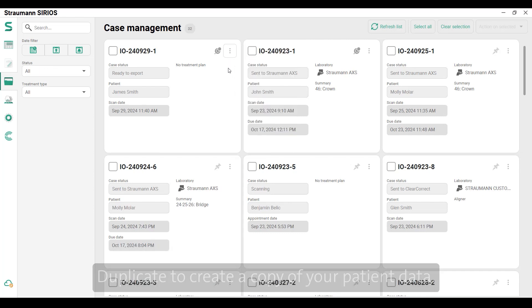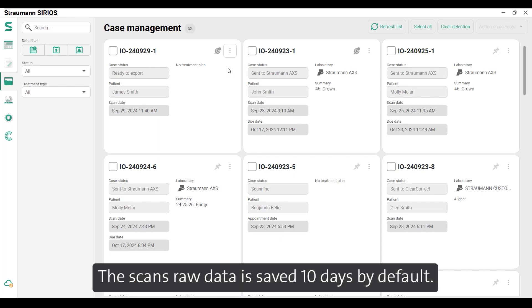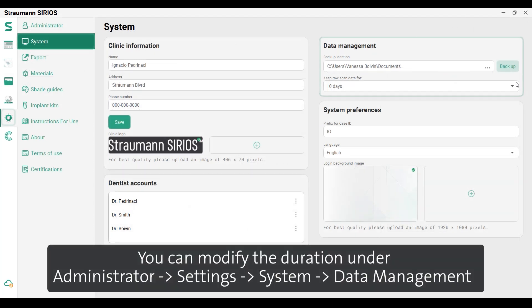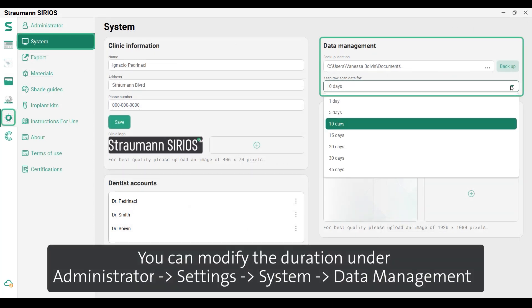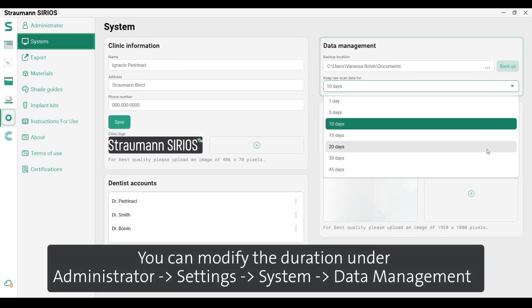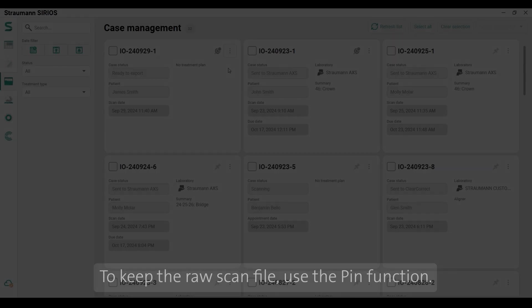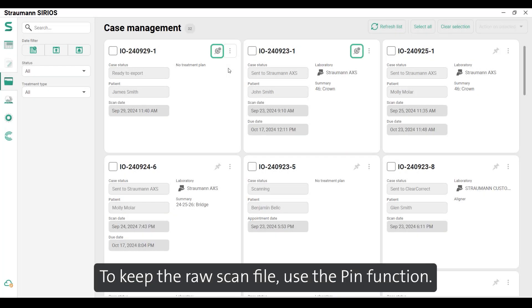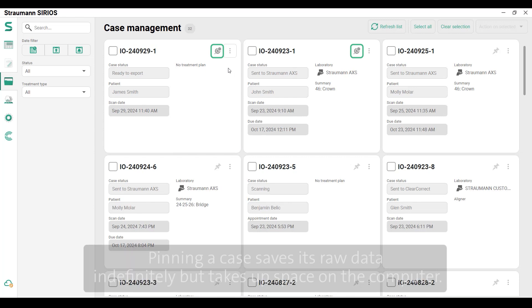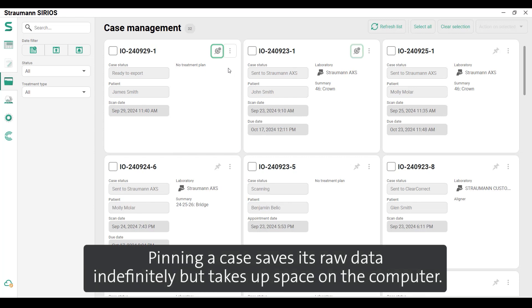Duplicate the case to create a copy of your patient data. The scan's raw data is saved for 10 days by default. You can modify the duration under Administrator, Settings, System, Data Management.